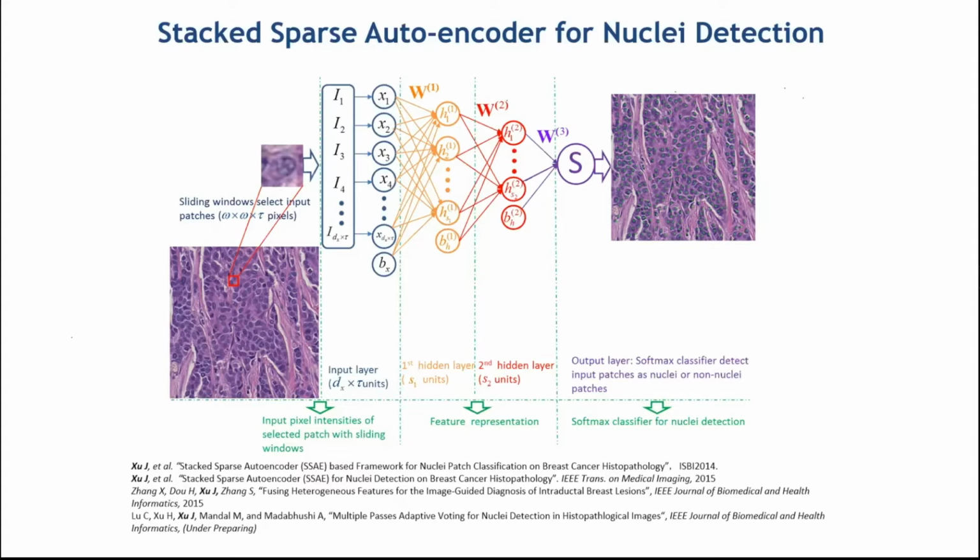And so the beauty is, in some ways, that these architectures, these neural network architectures that comprise deep learning, essentially involve providing as input annotated examples of these images. These images then go into the network. You've identified or labeled a bunch of these training exemplars, and then the network learns the best representation to separate out the category of interest from everything else, and then spits out the output.